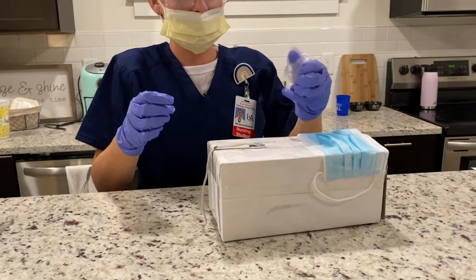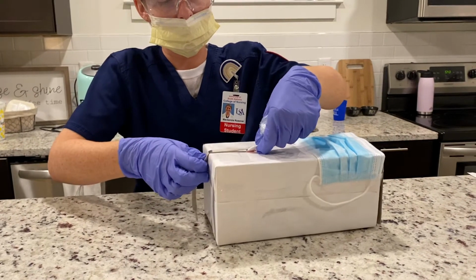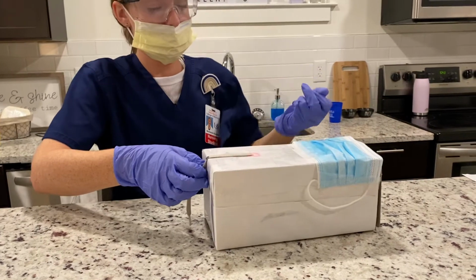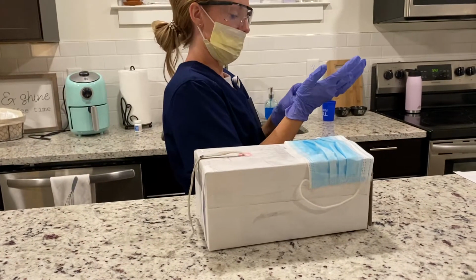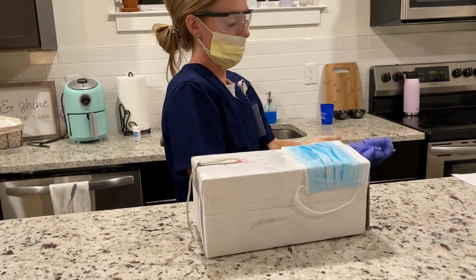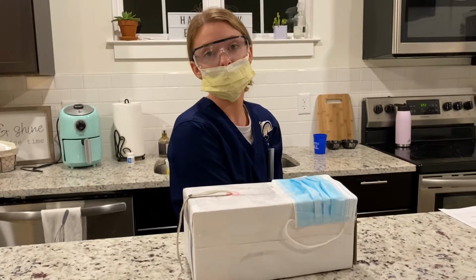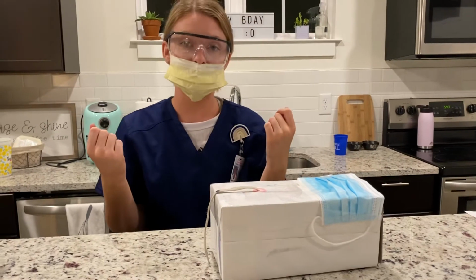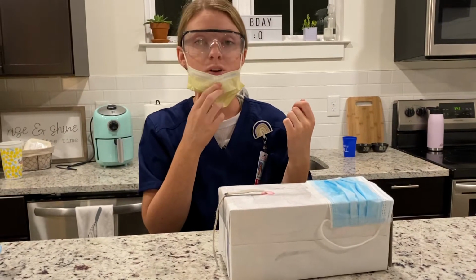And then I would also remove the biopatch. And at this time I would also obtain a wound culture if needed, and I would observe for any signs and symptoms of complications.